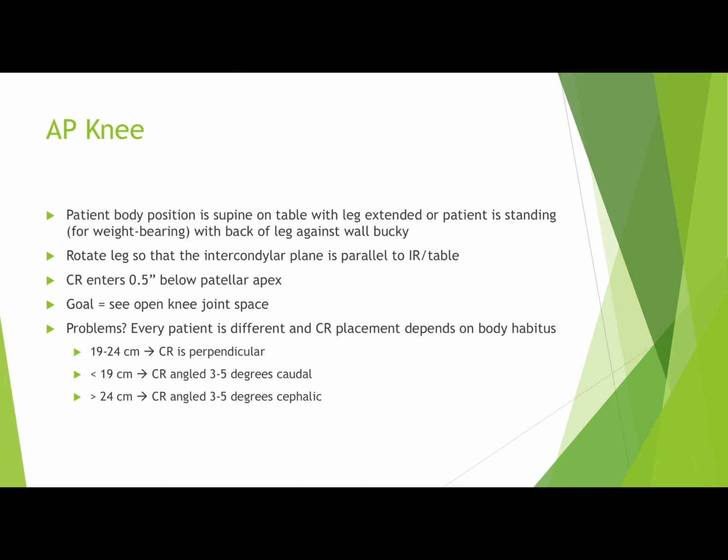So you just want to eyeball as well and see how thick your patient is to get the right angle of the central ray, but they're all going to be entering half an inch below the patellar apex.